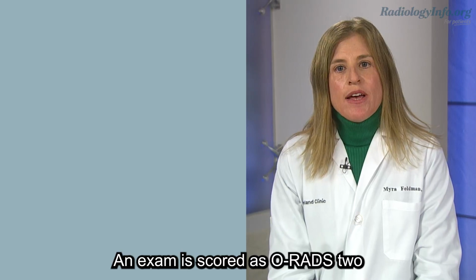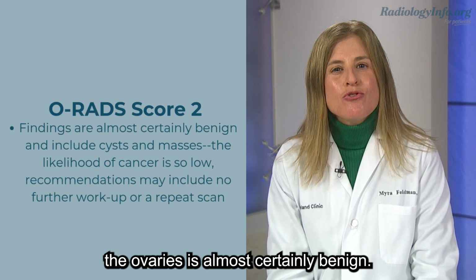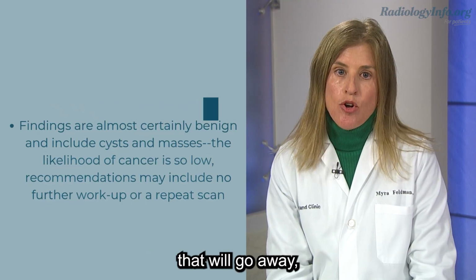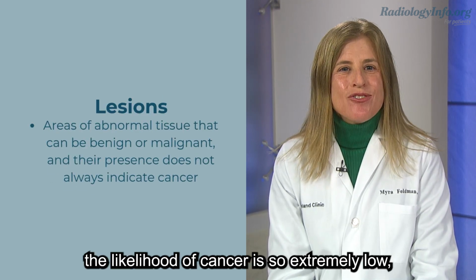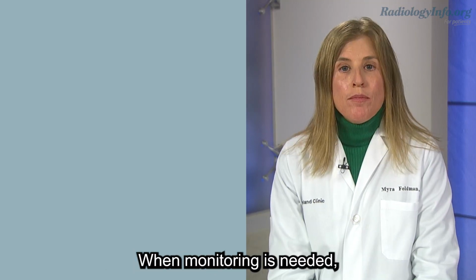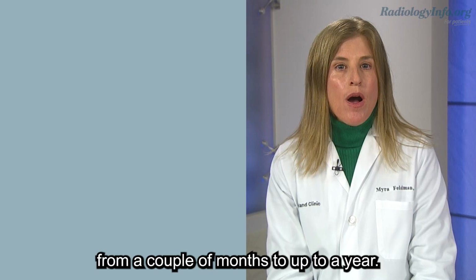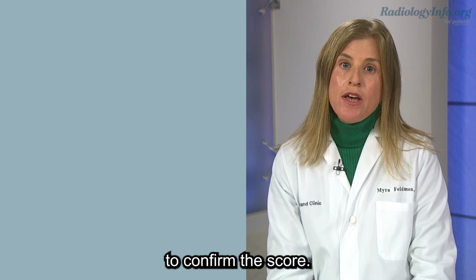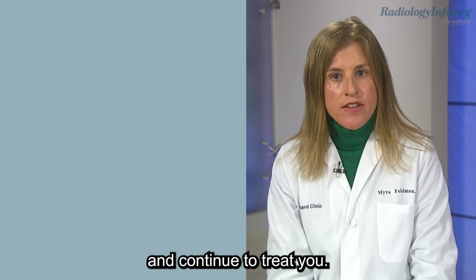An exam is scored as an O-RADS 2 when what is seen in and around the ovaries is almost certainly benign. Such observations include larger physiologic cysts that will go away, while others are lesions that will persist. In either event, the likelihood of cancer is so extremely low, most do not require any follow-up at all. When monitoring is needed, the recommendations will be in the report, and the follow-up can vary from a couple of months to up to a year. Rarely, an MRI of the pelvis is recommended to confirm the score. If your gynecologist ordered the exam, they will get the report and continue to treat you.